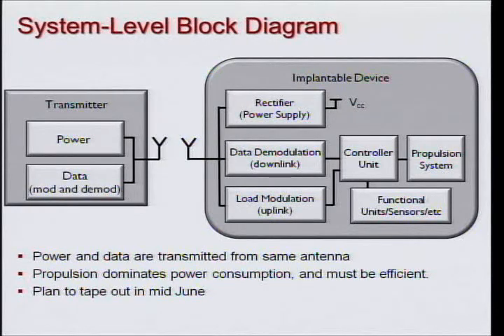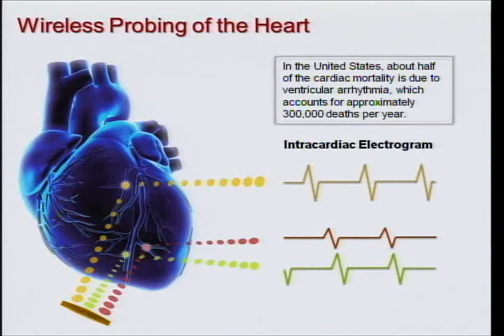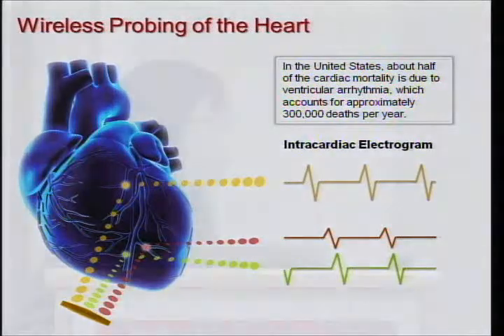The chip is 1 millimeter by 1 millimeter. The gadget, including the parts that make it like a kayak, is 3 millimeter by 3 millimeter. It has wireless powering, wireless control, and a wireless data link for the feedback. So let's see if it works in a few months. Another thing in wireless is that we always talk about distributed processing. Therefore, we work with cardiologists at Stanford Medical School and also Palo Alto Medical Foundation to do distributed sensing of the heart to reconstruct the electrical pathway, to see if it will help in the EP study and reduce the surgical time from 4 to 6 hours to maybe less than an hour.